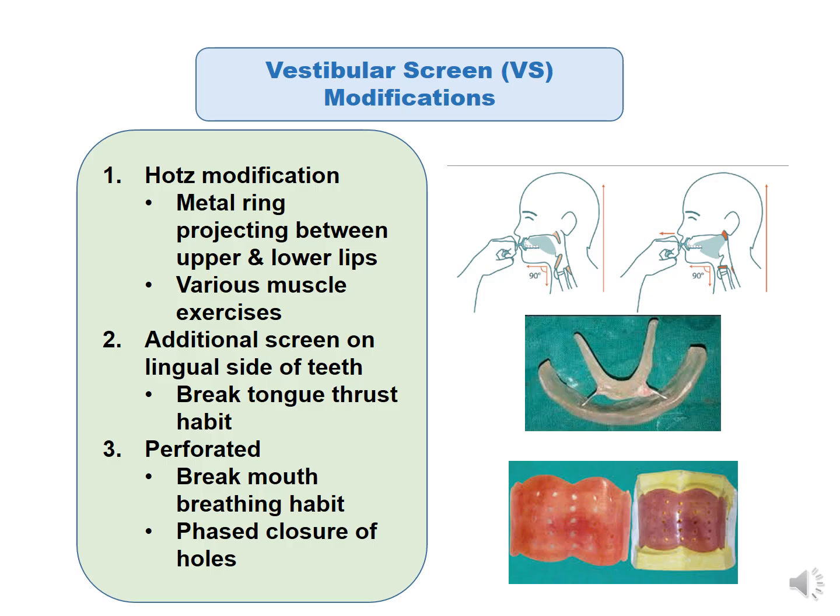Now, the third modification is to put perforations in the screen. The idea of these perforations is to break the mouth breathing habit, and as the habit changes, there's a phased closure of the holes in the vestibular screen.